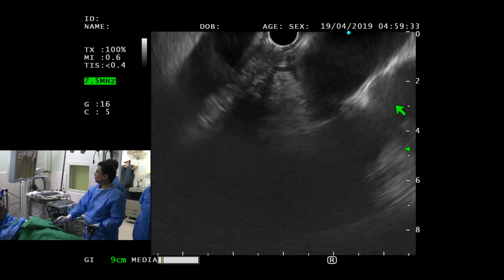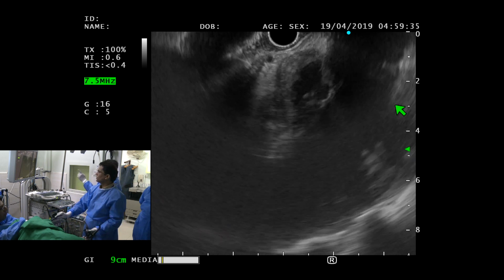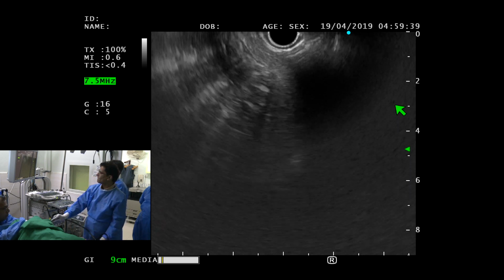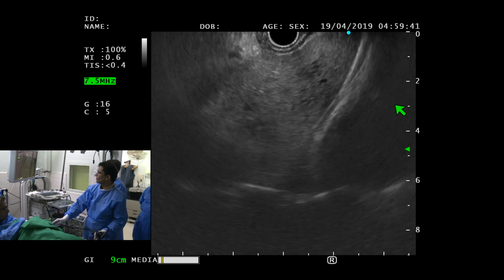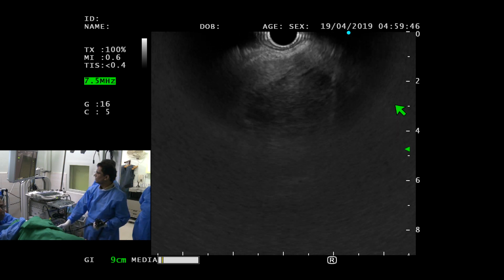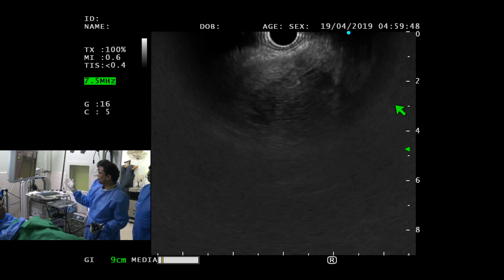Okay, so we've pulled the scope back because we're seeing the heart. So therefore, हमें scope को push करना है. ठीक हो गया? Lever, right? Okay. What should happen at this stage? You go. Okay, that's fine.